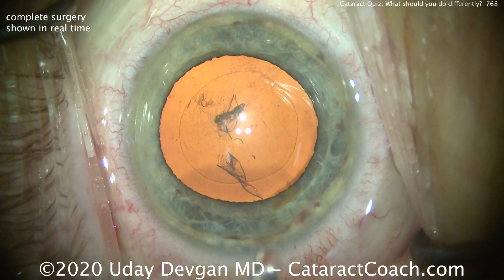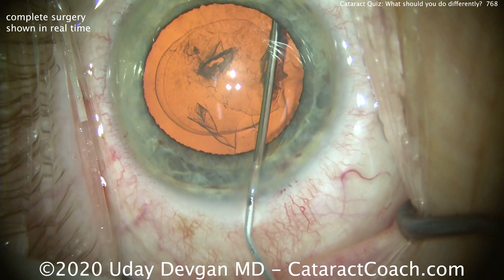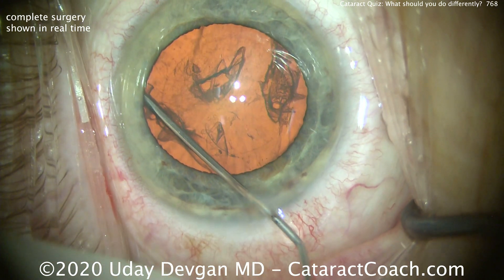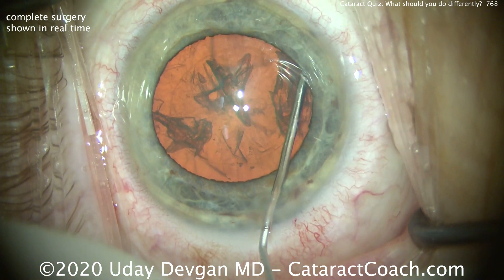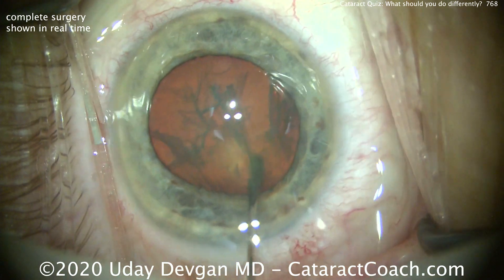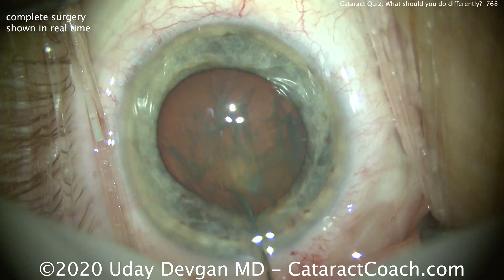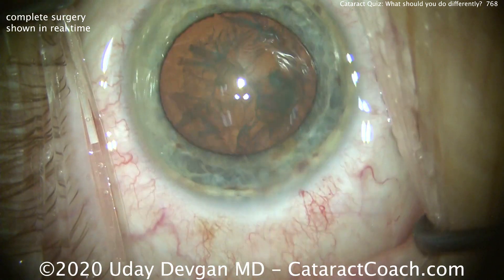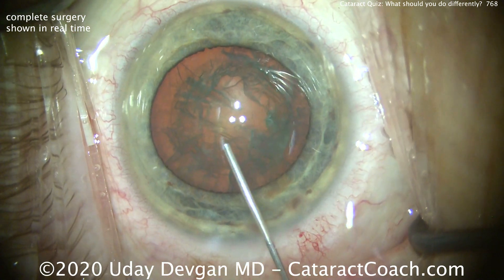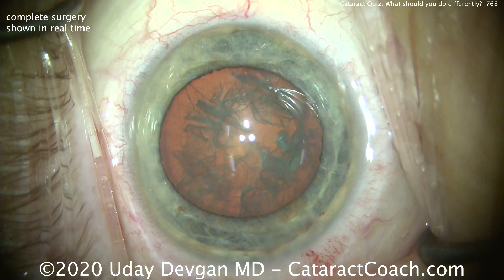Now time for hydrodissection. Watch carefully — we'll lose viscoelastic out the main incision. As we put BSS in the eye, we're going to displace something out of the eye, and there it is, burping out that viscoelastic. In this case, we're going to want to recoat the endothelium prior to putting the phaco probe inside the eye. We've rotated the nucleus — it looks good. Here's more dispersive agent recoating that endothelium, just centrally, the most important part.